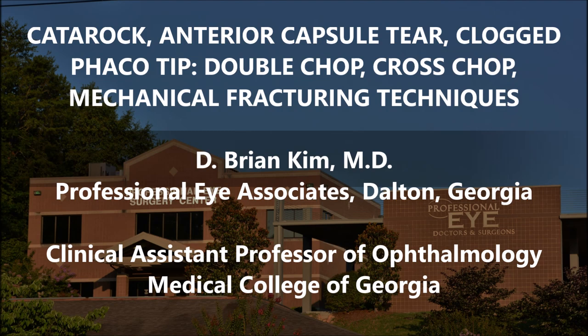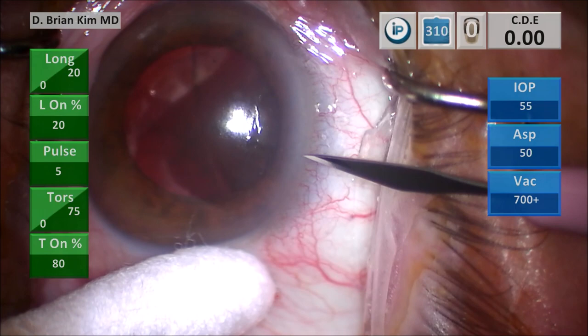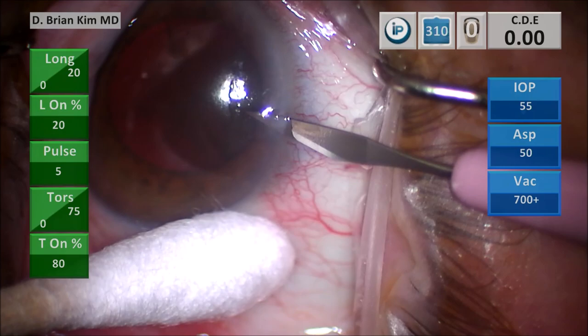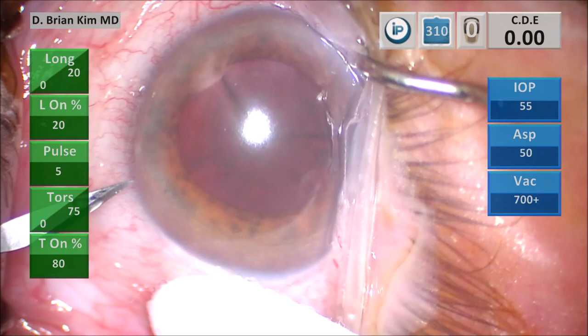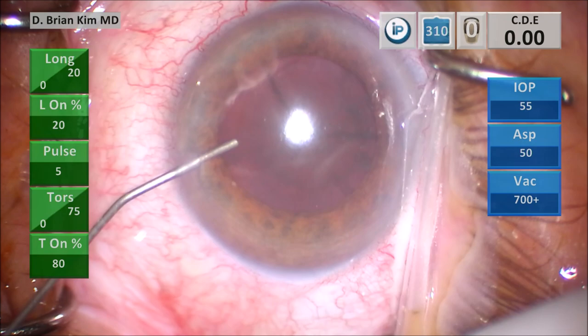I'm using a Q-tip to center the eye and then a corneal marker to help me center the capsulorhexis. I'm turning the eye with the cotton tip. In this case I have a metal blade for my paracentesis incision — first on the right side and then the left side; this is a left eye. You want to make sure you're flat to the iris plane to get a nice corneal shelf, which will allow a self-sealing corneal incision. I'm injecting some intracameral lidocaine and then intracameral air.